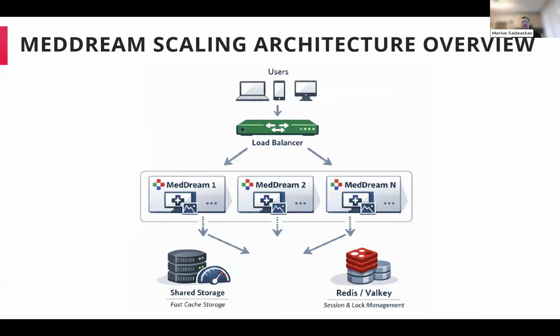So here is, very briefly, the workflow of how this scaling and high availability architecture would look. In principle, the user connecting from any of the devices goes to MedDream through the load balancer, which then redirects to running multiple MedDream nodes.